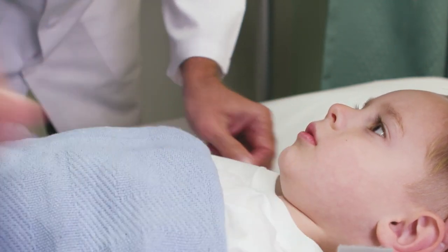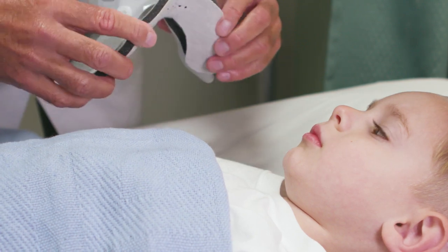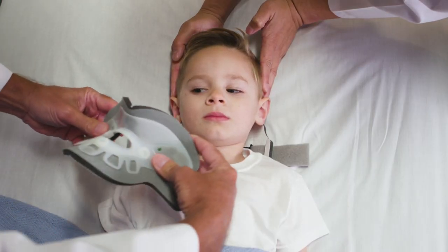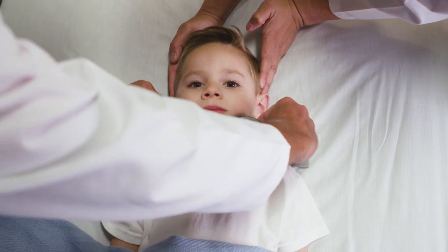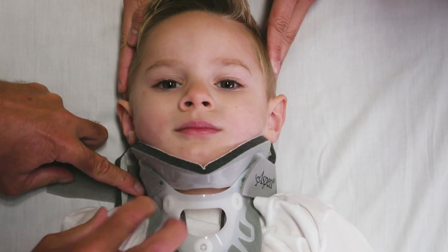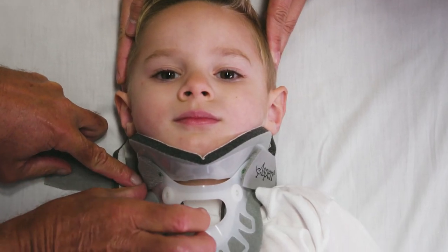After positioning the back panel, gently squeeze the front panel for easy application. Slightly pull the side panels of the collar apart and scoop the front panel up and under the chin so that the chin comes to the front end of the chin piece. Then position the sides of the front panel over the trapezius muscles.